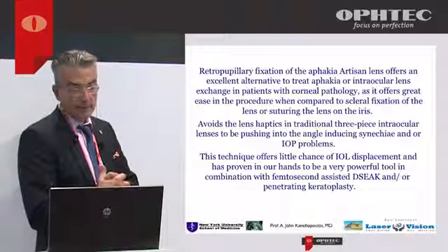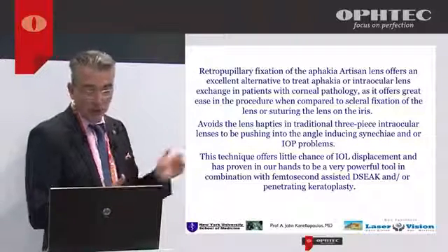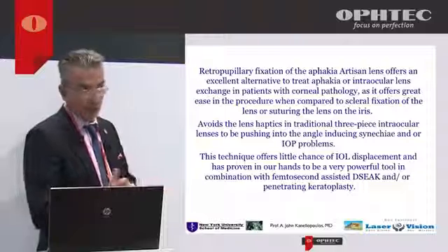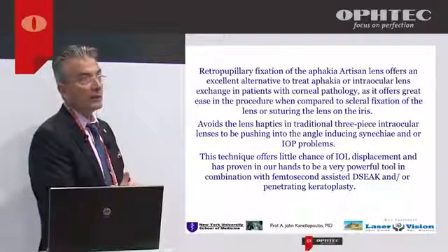And I think the only thing I blame myself for is not thinking about this when I first started to work with a lens, when we used it in the anterior chamber. I think it's far easier, more physiological, and matches well with other anterior segment procedures.